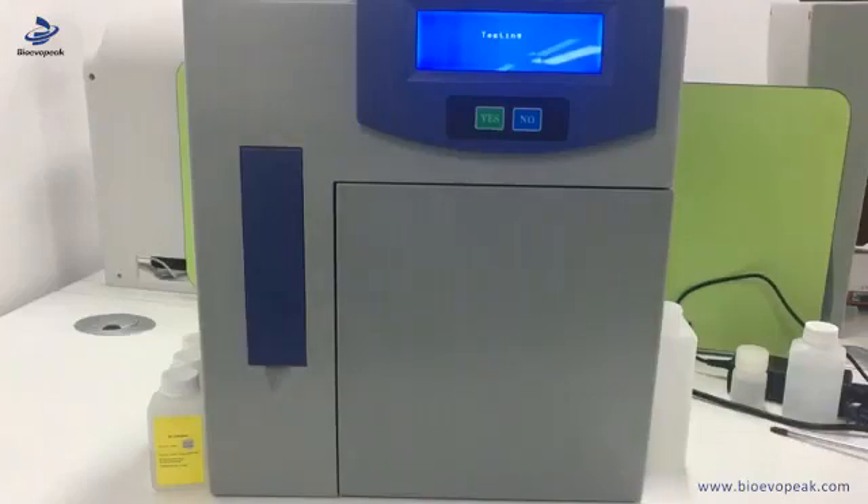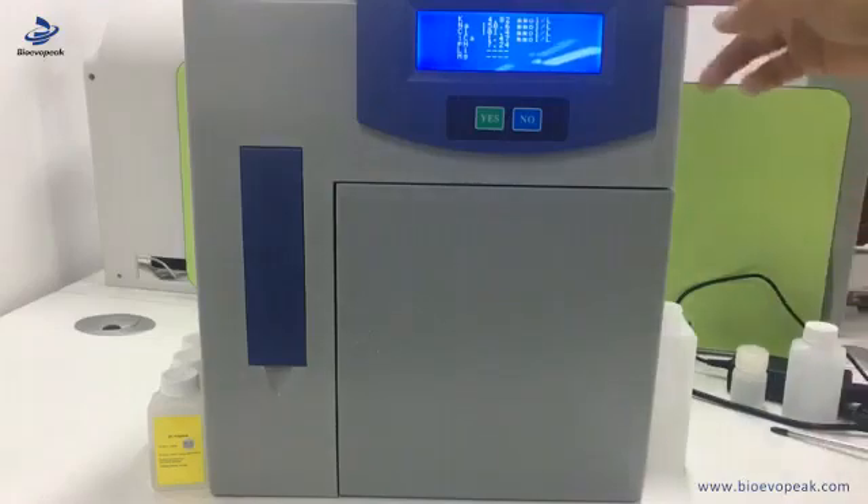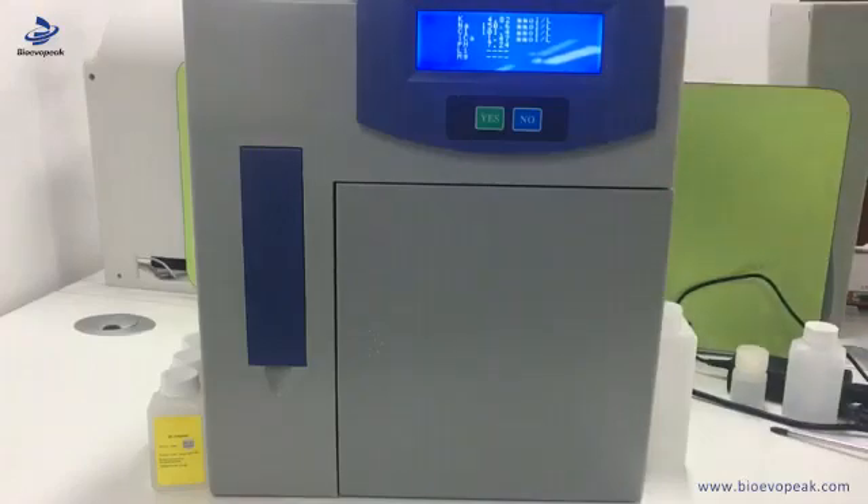Then the machine will do the testing. Wait for a while and it will show you the result. During the absorbing of the sample, we need to avoid absorbing blood cells into the pipe as it will block the pipeline — so only use the serum. Now it shows the result on the screen and will also print on paper.